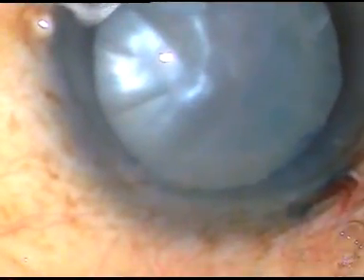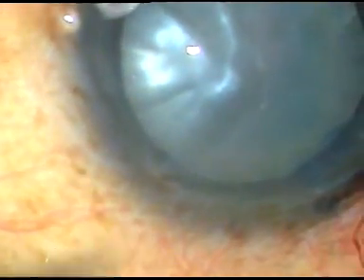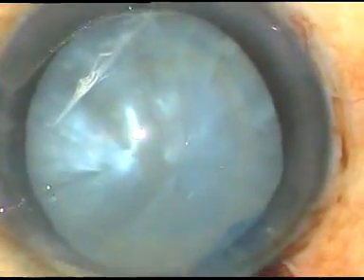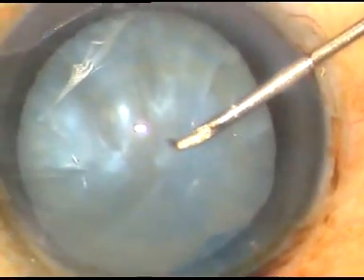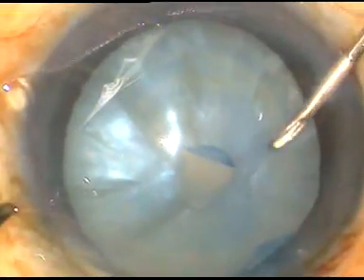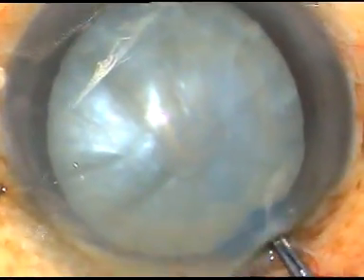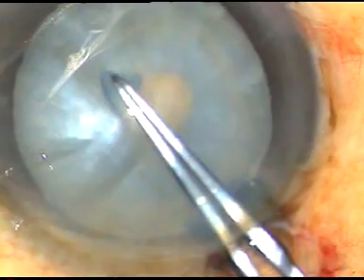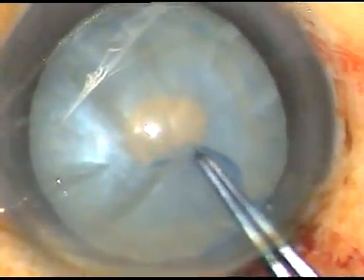Capsulotomy is to be done. I incise the anterior capsule at the pole with a 26-gauge bent needle. The anterior capsule is punctured and a C-flap is made. You can see that a bit of fluid is coming out. Now I hold this capsular tag and make a small rhexis at this site.